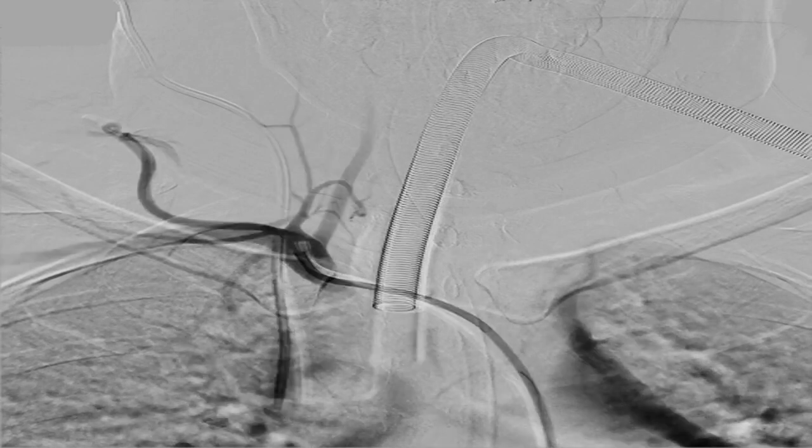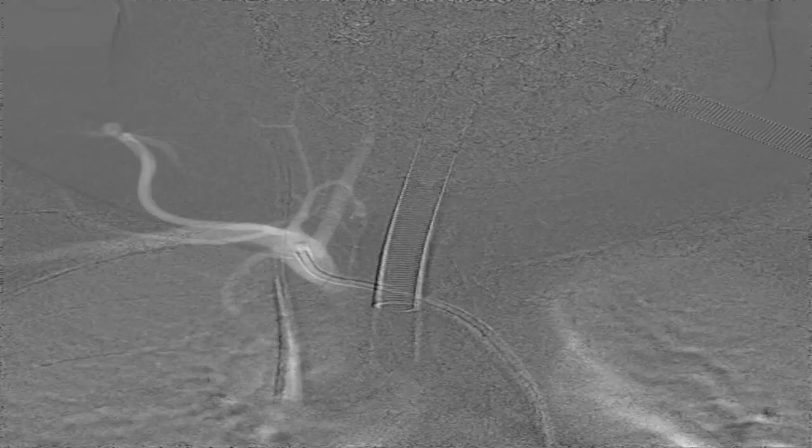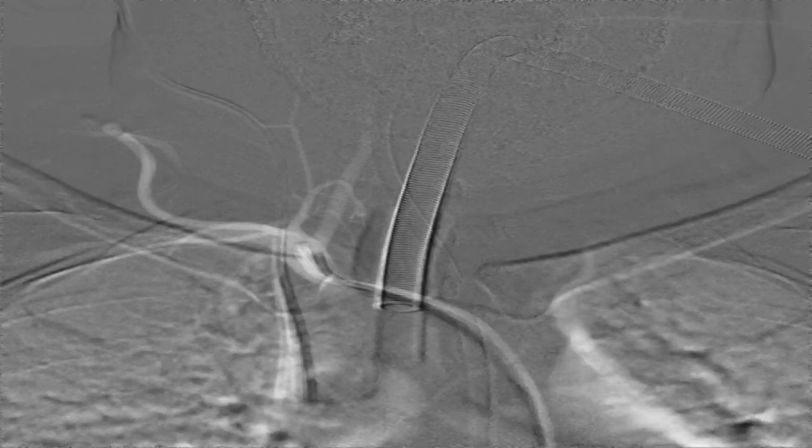For right vertebral artery catheterization, we withdraw our catheter in the brachiocephalic trunk, take a DSA of the brachiocephalic trunk, advance the wire in the right vertebral artery, and over it the catheter is passed. We do not need to advance the catheter beyond its opening for diagnostic DSA. From the opening, we take biplane DSA of the vertebral artery.